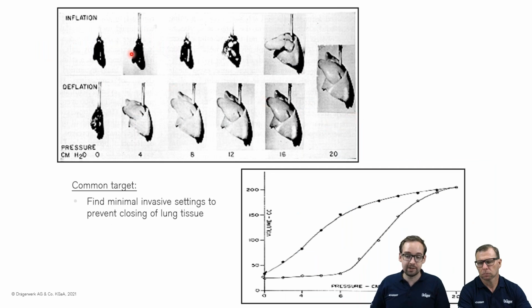Remember our picture from the beginning. What we're trying to understand here is the hysteresis of this particular patient, because every patient has a unique PV loop, and this PV loop is even dependent on ventilation history, previous recruitment maneuvers, previous PEEP levels. So you will see that this low flow PV loop is highly dependent on where the lung is at this moment in time. Where are we in the weaning process? Where are we in the lung recruitment process? So, trying to open the lung and see, of course, how it's behaving on the closing side.